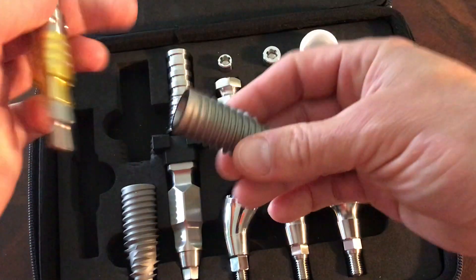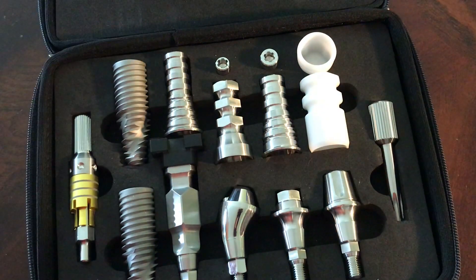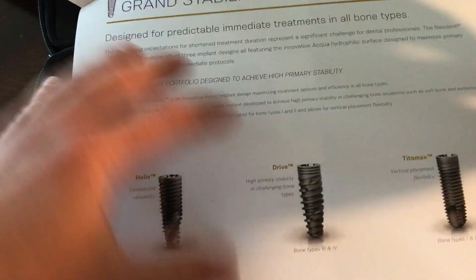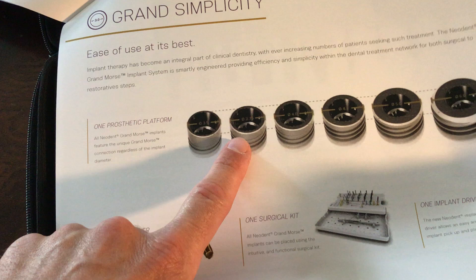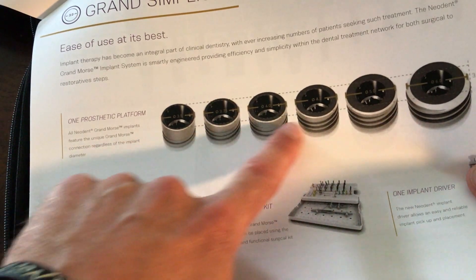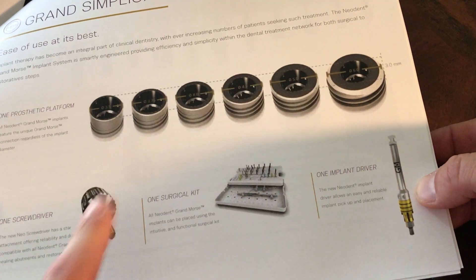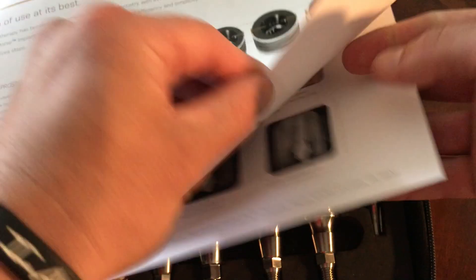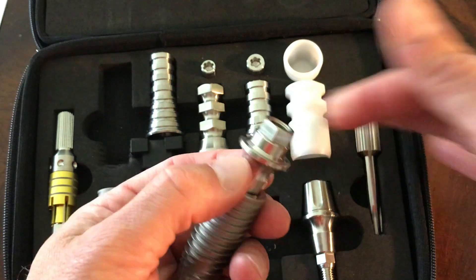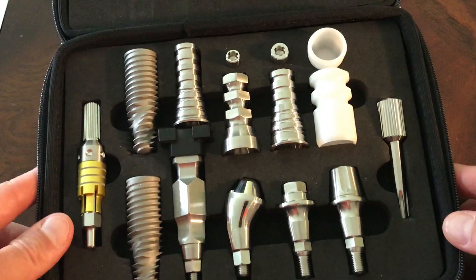The other thing I really like is the new design in this driver — it's one driver that fits all types of implants, meaning the different diameters. In this system we have a 3.5, a 3.75, a 4.0, 4.3, 5.0, and they're even adding a 6.0 within the next month. So we have six different diameters of this implant that all use one implant driver. That also means all of your parts — every type of abutment goes into the top.